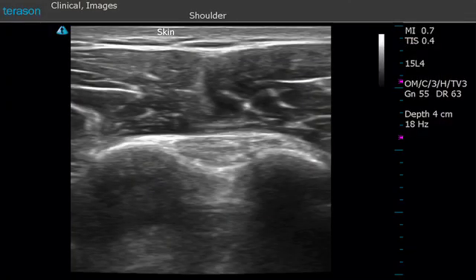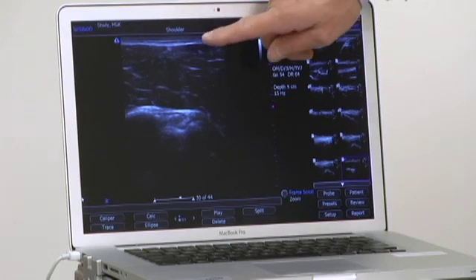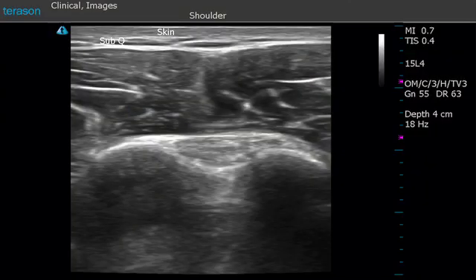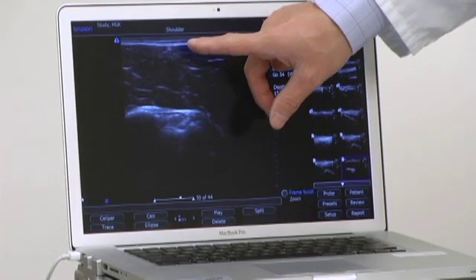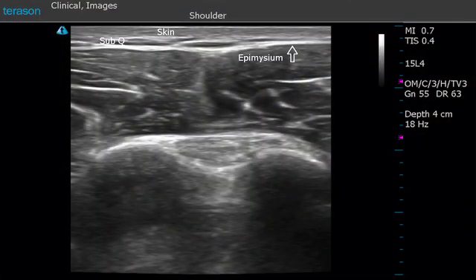On this image, we see the skin at the top of the picture as the bright area just underneath the probe surface. There's a small dark area right in through here that represents a little bit of subcutaneous tissue. This patient has very little fat and consequently we don't see much of that, but it would appear dark.